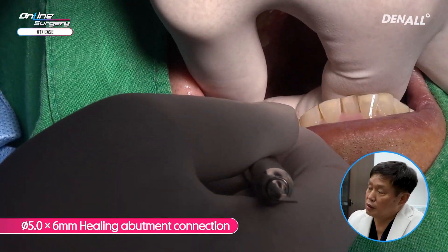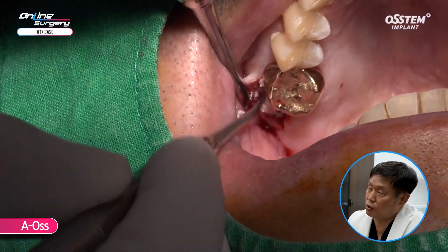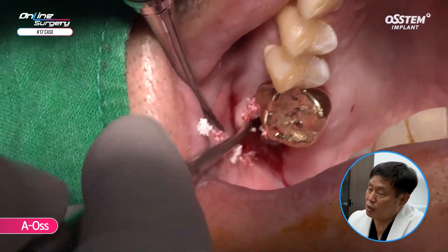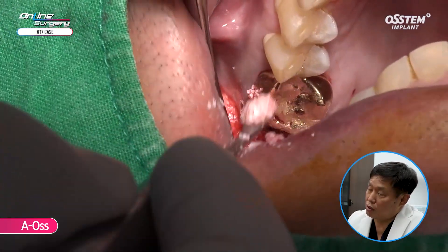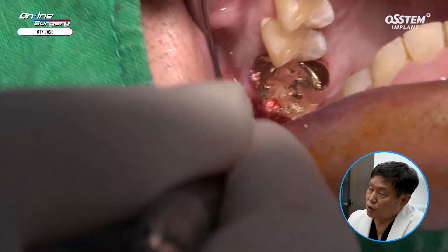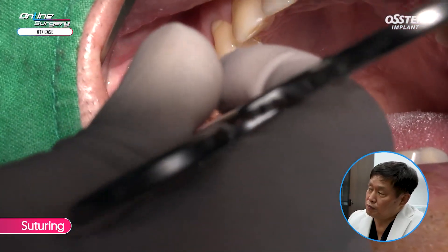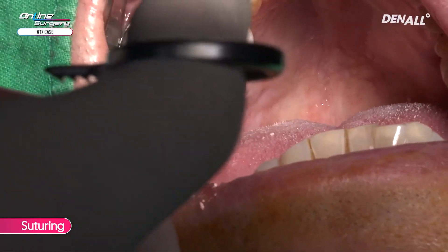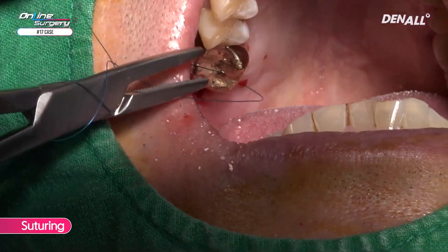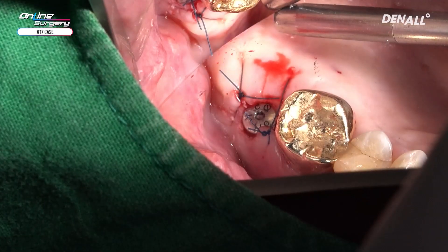After that, on the buccal side, because there was an area where there was lack of bone formation, EOS particle bone was used. Flap reflection on the buccal side was not done excessively. Sufficient bone packing was done on the buccal side. Because this was a minor incision, suture was performed as shown. This was the surgical clip.